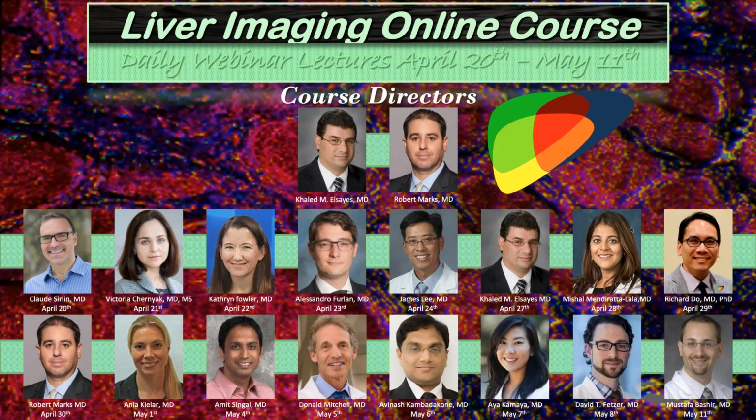This could very well be foci within the tumor that are dedifferentiated, nodule-in-nodule appearance. So this would greatly elevate your confidence that it's malignant change, even if, as you previously defined it, the size is the same. Does that help address, or is there anything else you'd like to add to that?